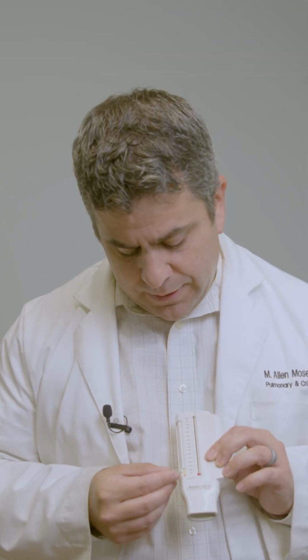There's green, there's yellow, and there's red. Obviously green is good, yellow is not so good, red's bad. And so when you see us in clinic, we're going to give you some zones based on what your breathing tests look like so that you can know how your zones are doing and what they're supposed to be. Because everybody's zones are a little bit different. I'm a short guy, and so my zones are lower than someone who's very tall. In your clinic, you will be alerted as to what your active zones should be and where a good number is versus a yellow number versus a red number.